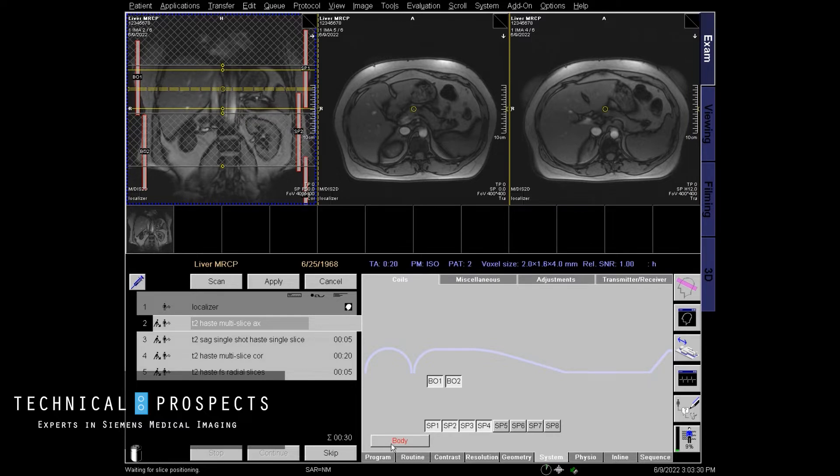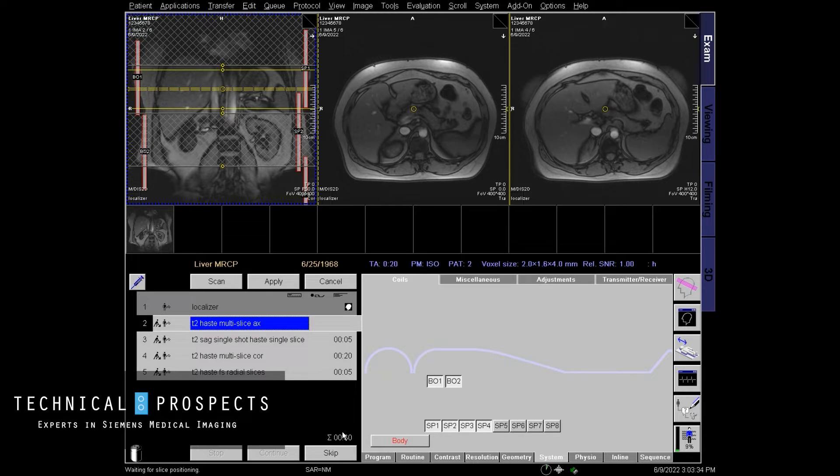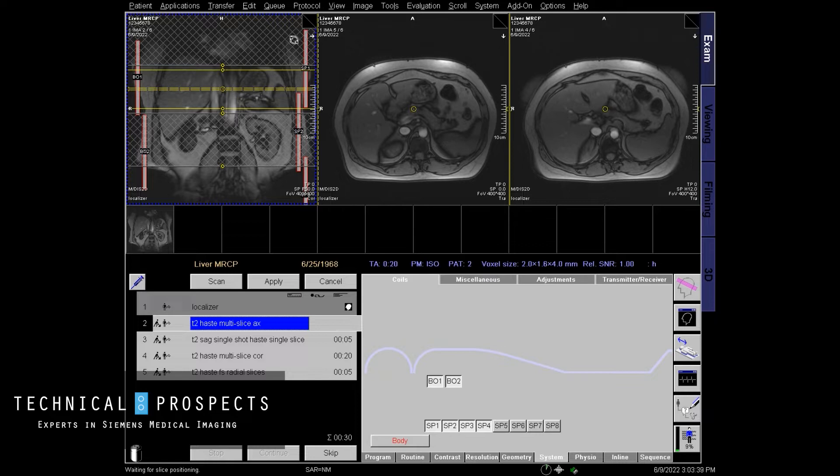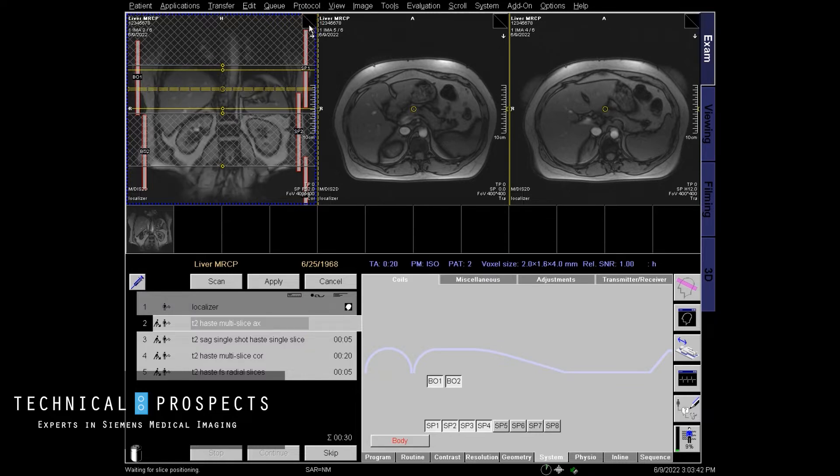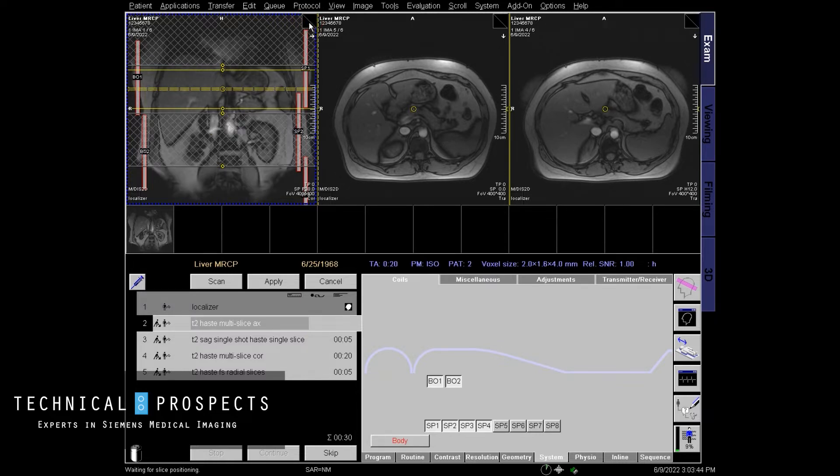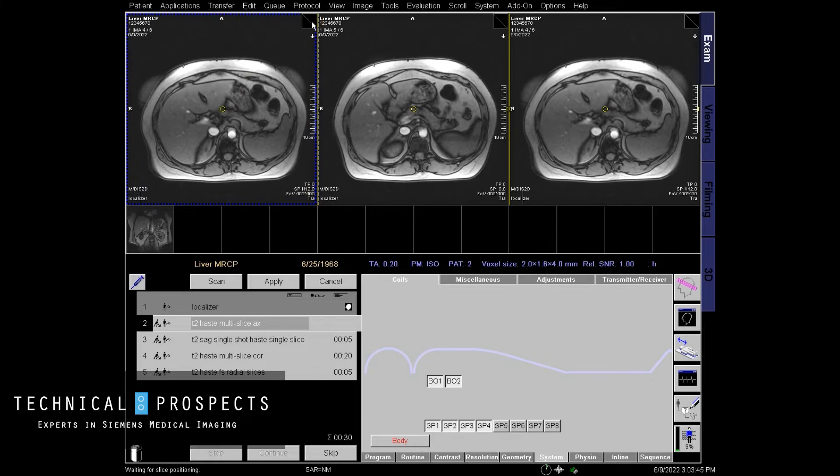I like to do a little prep scanning before I actually do my radials and one particular sequence I like to run is a HASTE sequence, multi-slice, right over where you would probably think that the biliary tree would be at.